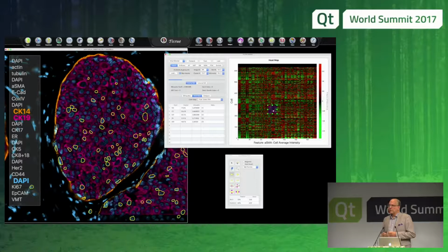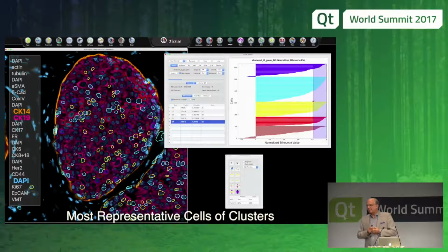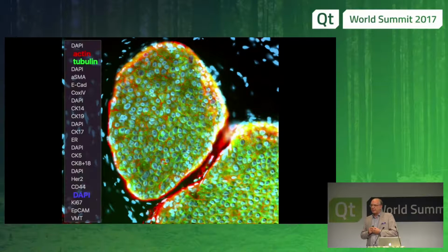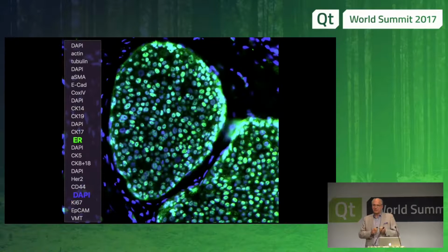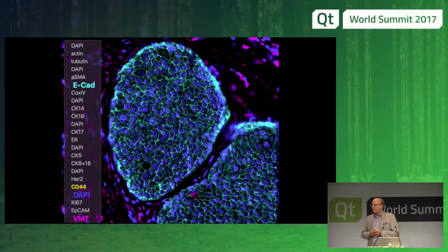We go into statistical analysis of those cell data spaces, do cluster analysis, do deep learning, and pattern recognition. There are a number of statistical methods to reduce the dimensionality of such a data set and be guided to locations where the cell is not behaving as you would expect it to behave, or where particular portions of the tissue are becoming malignant.